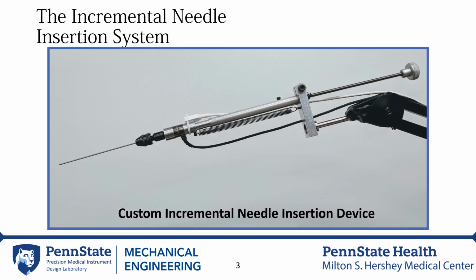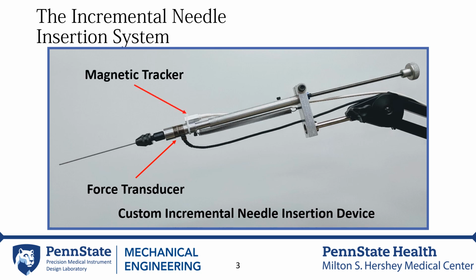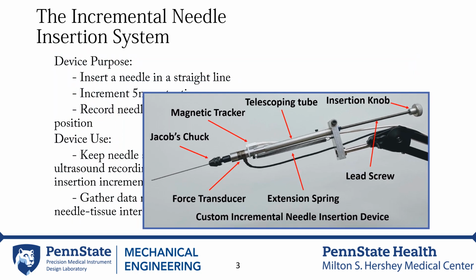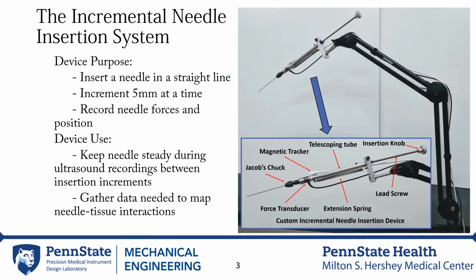The system, pictured here, uses a 6-axis force transducer to record the forces involved in insertion and an electromagnetic probe to track position. It has a lead screw and a telescoping tube allowing for 5 millimeters of translation for every full knob rotation. An extension spring keeps the needle in place between movements, and a Jacobs chuck allows for versatility in needle sizes. The device is mounted to an articulating arm, which allows the device to be easily positioned to various insertion sites while keeping the device in place during insertion.